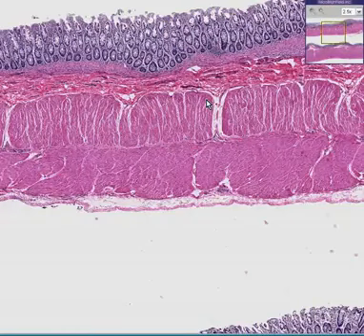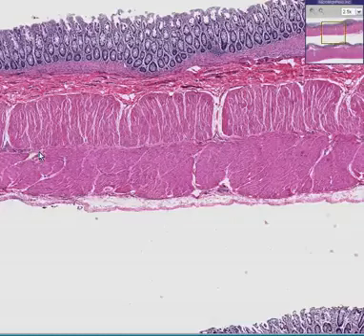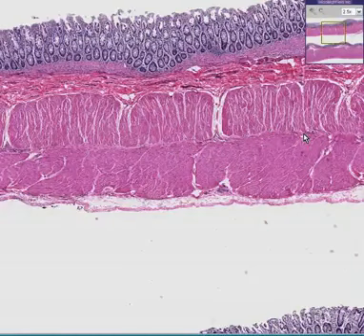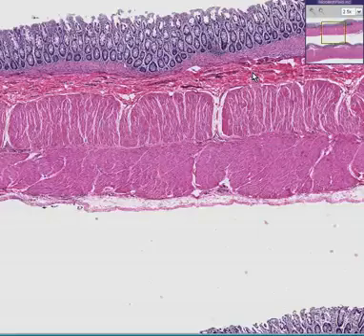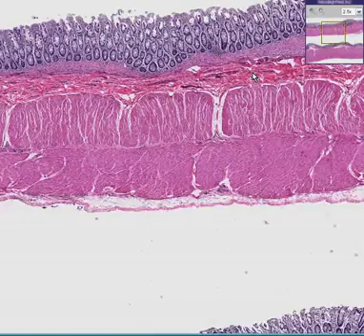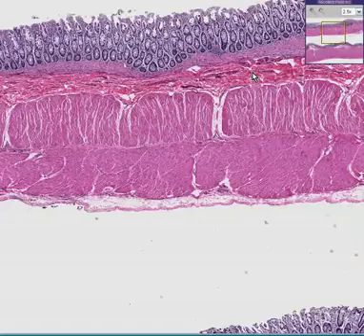One is in the submucosa of the colon, and the other is the so-called myenteric plexus between the circular and longitudinal layers. The myenteric plexus of Auerbach is usually easier to find, and sometimes you have to look a little harder to find the submucosal Meissner's plexus. They are ganglion cells. It's like the bowel's own intrinsic brain cells, and they can operate completely independently of central nervous system control. And when we were all worms, that's probably where our brains were, inside our colon.